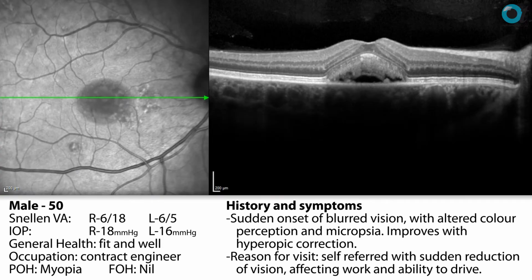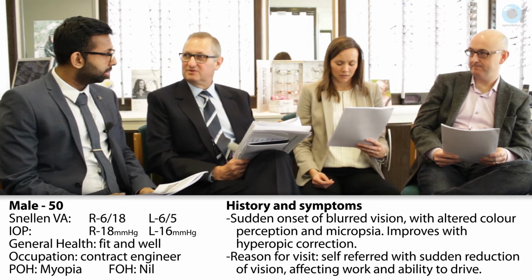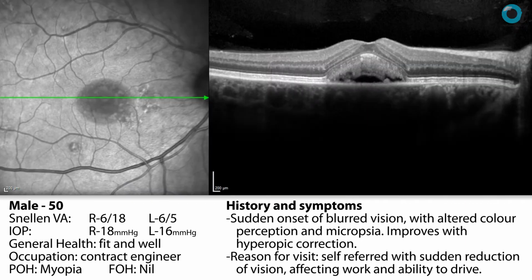Is there anything on the images that we've provided that might make you make that decision? There may well be, but I haven't got the knowledge to interpret that. My experience of looking at OCTs, there may be some subtle signs that would tell us that, but I wouldn't know what they are. Has anybody else got that experience? We're a relatively experienced group, so not enough to say much more than, either side of the obvious lesion, you've got quite a nice photoreceptor line, and it elevates and it becomes slightly white and thicker in the middle, and then comes back down again. And I don't know whether that is an indication of how long-standing something is or not.